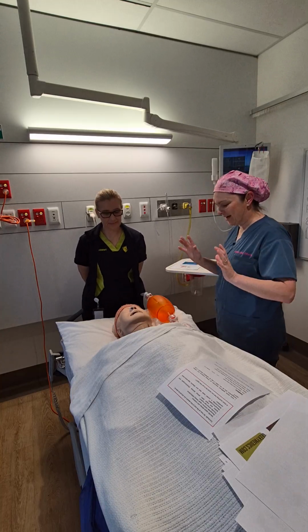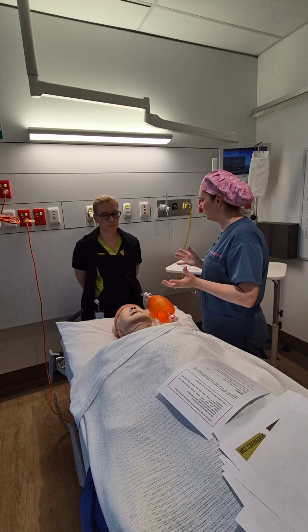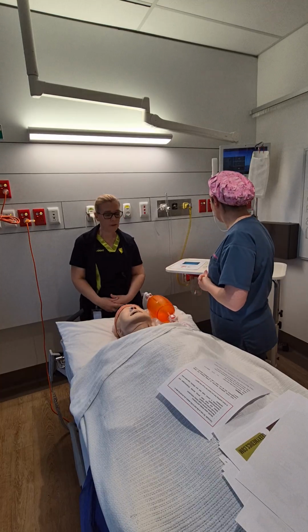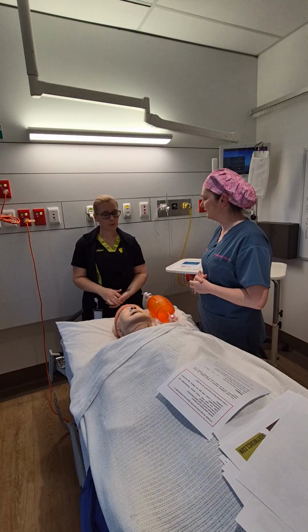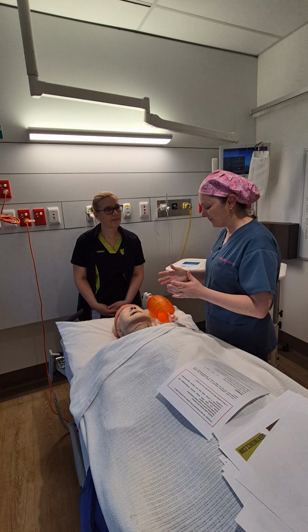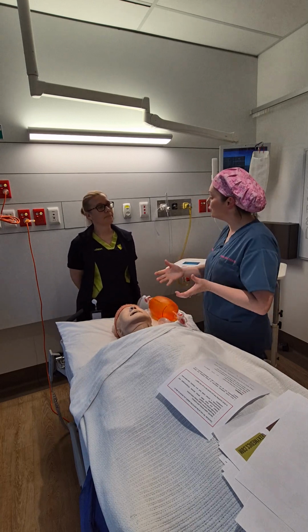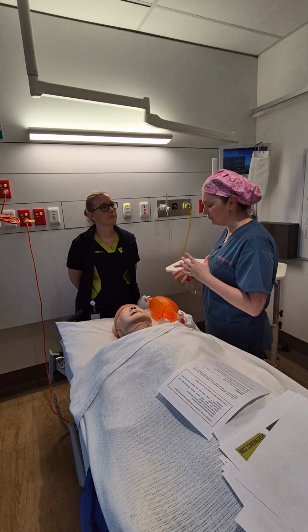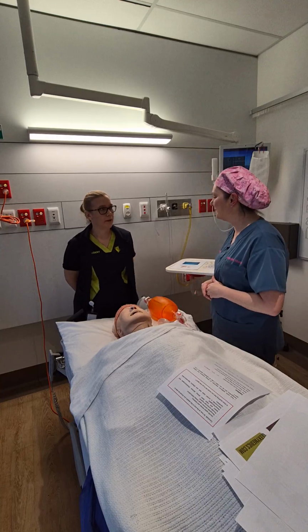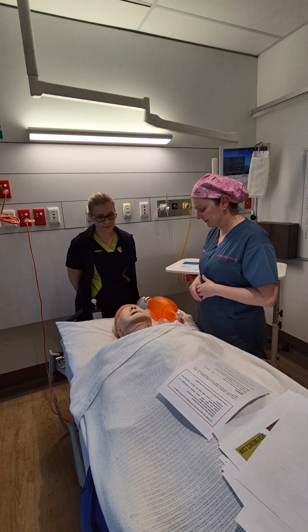That's okay. So just as a follow-up to that session, what do you think went well in the session? I liked how you went through all the different equipment and how to use it, and talked it through in an easy way to understand. Oh, wonderful. Thank you. So with the skills that you performed, the oropharyngeal, the nasopharyngeal, the jaw support, and the bag mask ventilation, what do you feel like you did best? Probably the bag. I thought you did your jaw support. Oh, okay. Great. Nice, easy, good technique.